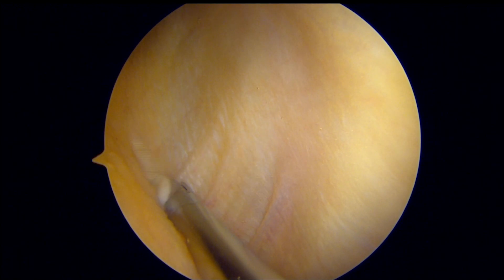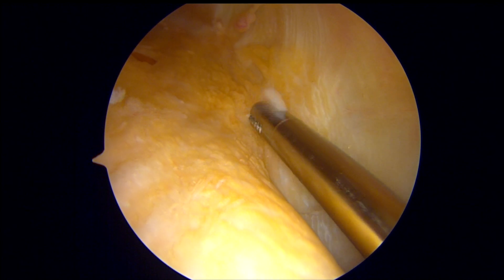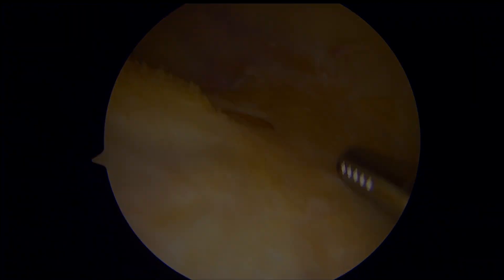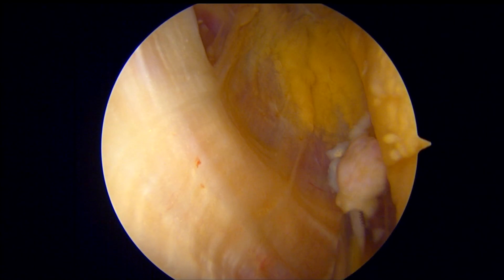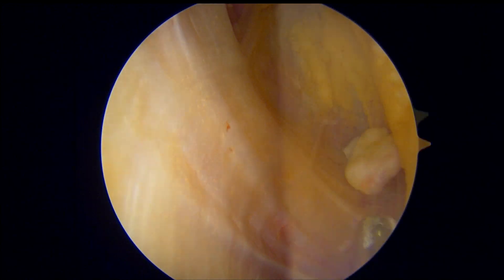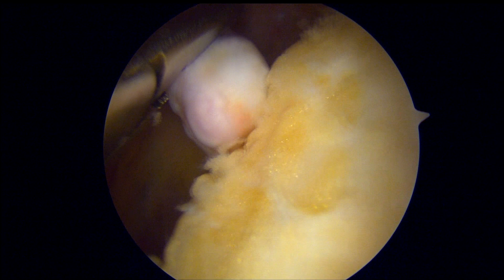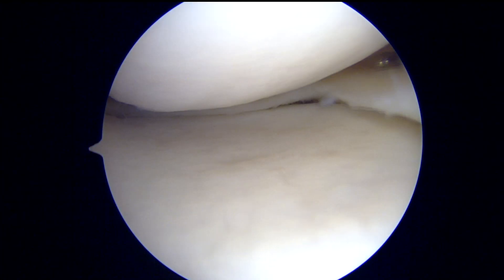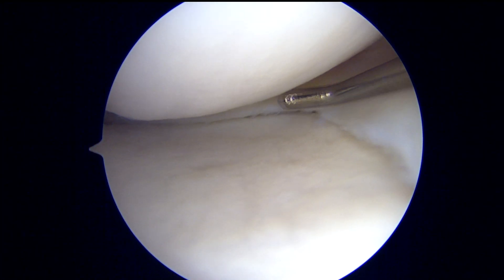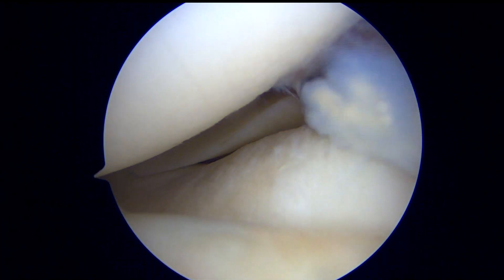It is really important in this surgery that we assess all compartments of the knee — the suprapatellar pouch, the medial gutter, and here now the lateral gutter, where you can see a hardened loose body. With synovial chondromatosis, the loose bodies come in various different stages — some can be hard in nature, while others are more soft cartilaginous lesions.